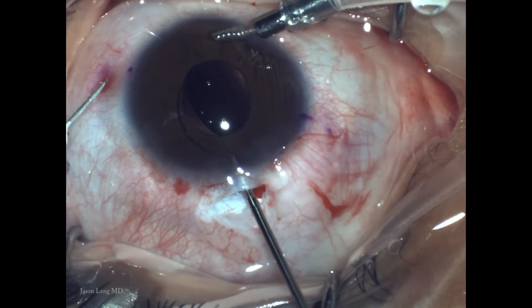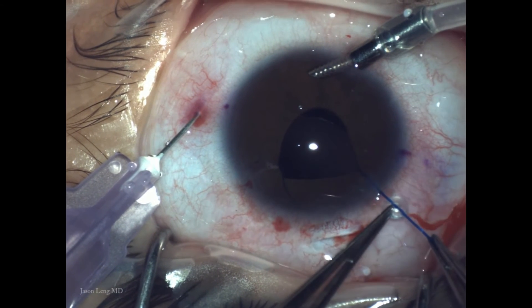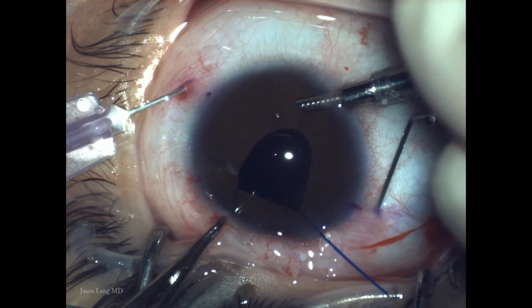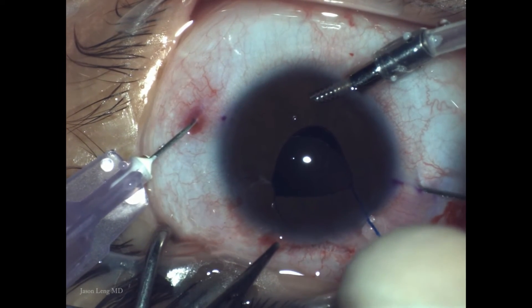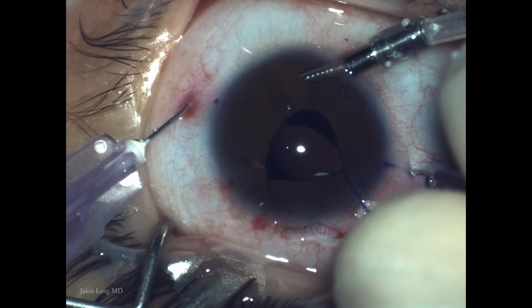I've let go of the first needle and it's quite deep — what it does is rotate the lens clockwise so the trailing haptic angle is more direct toward the second needle. I placed an iris hook for better visualization, and with the second needle I'm again entering through the conjunctiva and sclera at about a 30-degree angle.